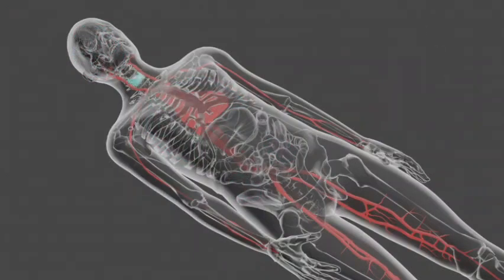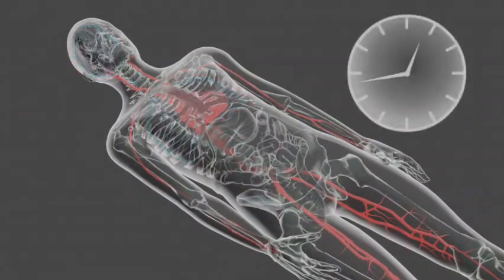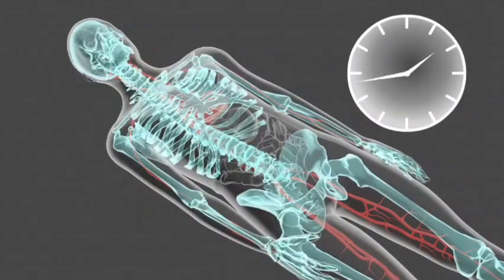Because some body functions are fast and some are slower, the time between the administration of the tracer and the scan can vary from minutes to hours. Some people are even required to come back on multiple days.